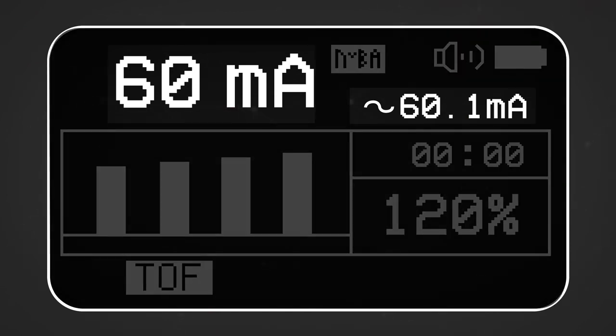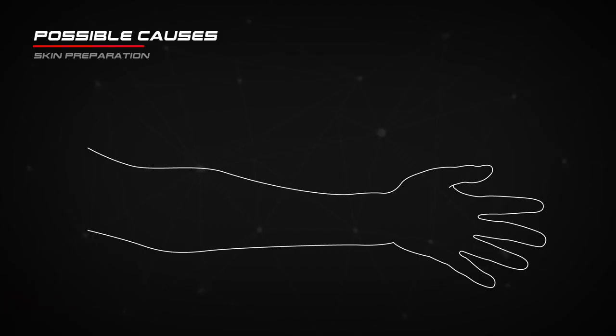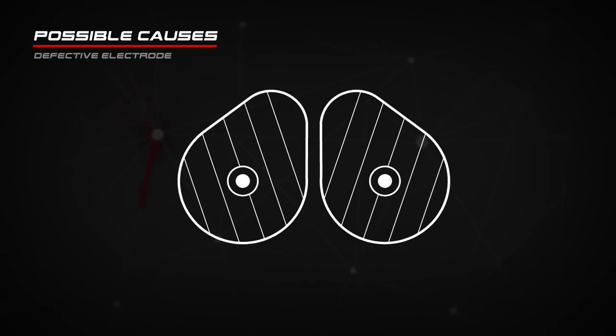If the current delivered is much less than the current setting, there's a problem with the electrode skin interface. Possible causes include a need for skin preparation or a defective electrode.